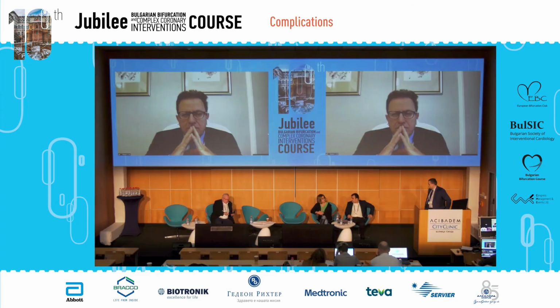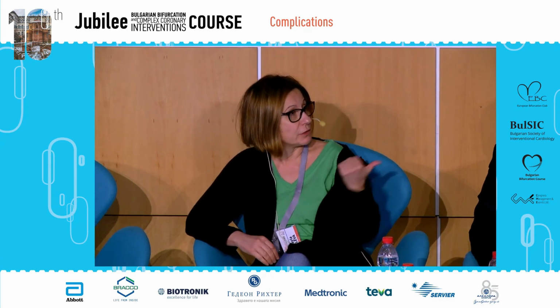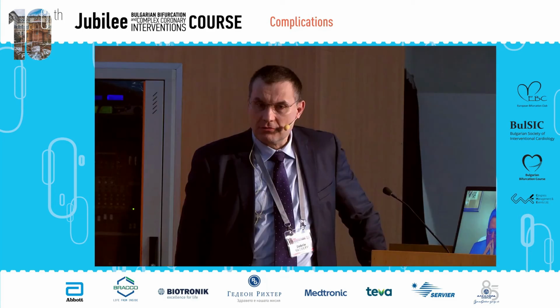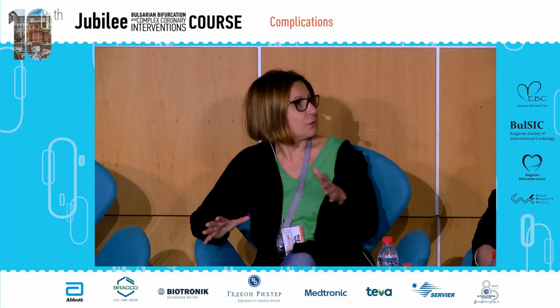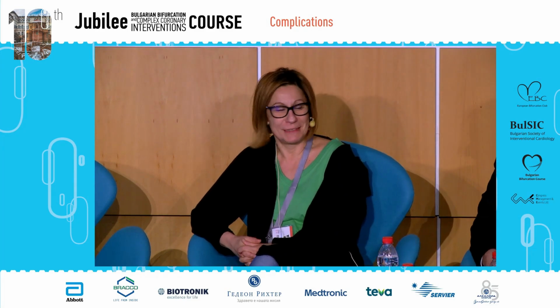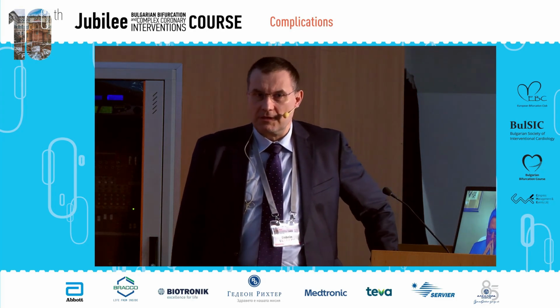I have a question with this POCI technique. Are you afraid of some compromising of the ostium of the stent to LAD in this situation, in the second case? How does it look with the IVUS, the ostium of the LAD, because you're sure with the ostium of circumflex? No, I'm pretty sure, absolutely sure about the ostium.